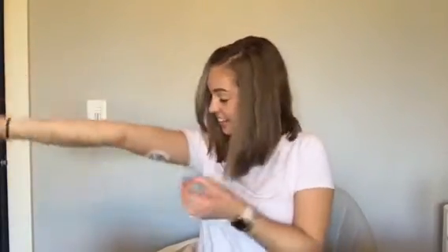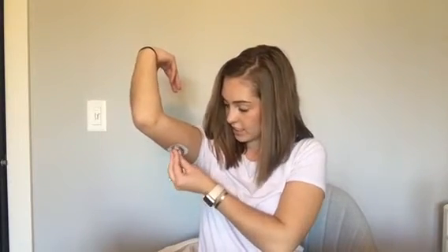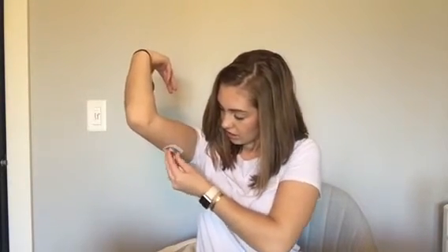That was so — I didn't even feel it. That's crazy. So then I'm going to slide the sensor in and snap it, and get it started on the app.